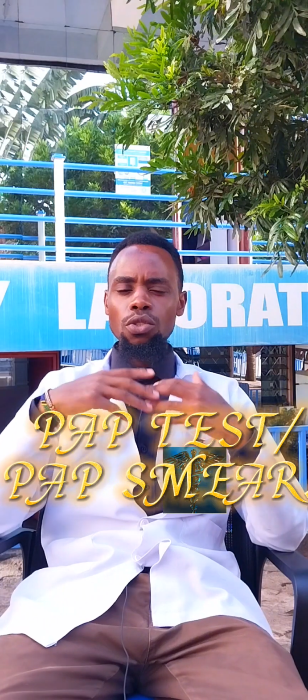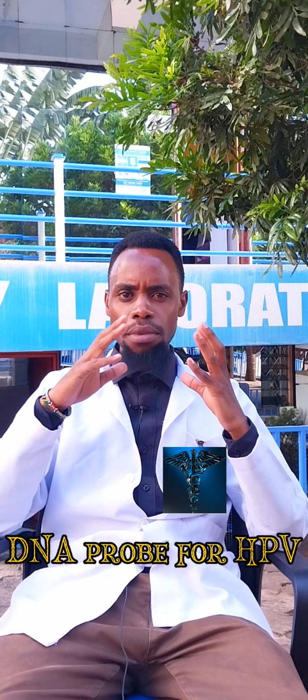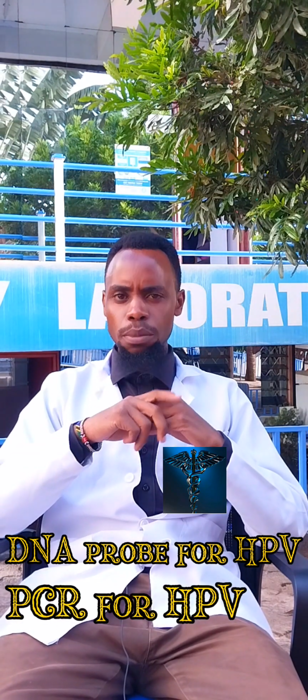We mentioned earlier about the screening test. We talked about the cervical screening test, that is the pap test or the pap smear, which is used to detect any abnormality in the cells of the cervix. We also talked about the HPV screening tests, that is the DNA probe for HPV, and also the PCR for HPV. So for us to screen for cervical cancer, we have to obtain our specimen from your cervix. And I'm going to show you how we are going to obtain our specimen from your cervix.